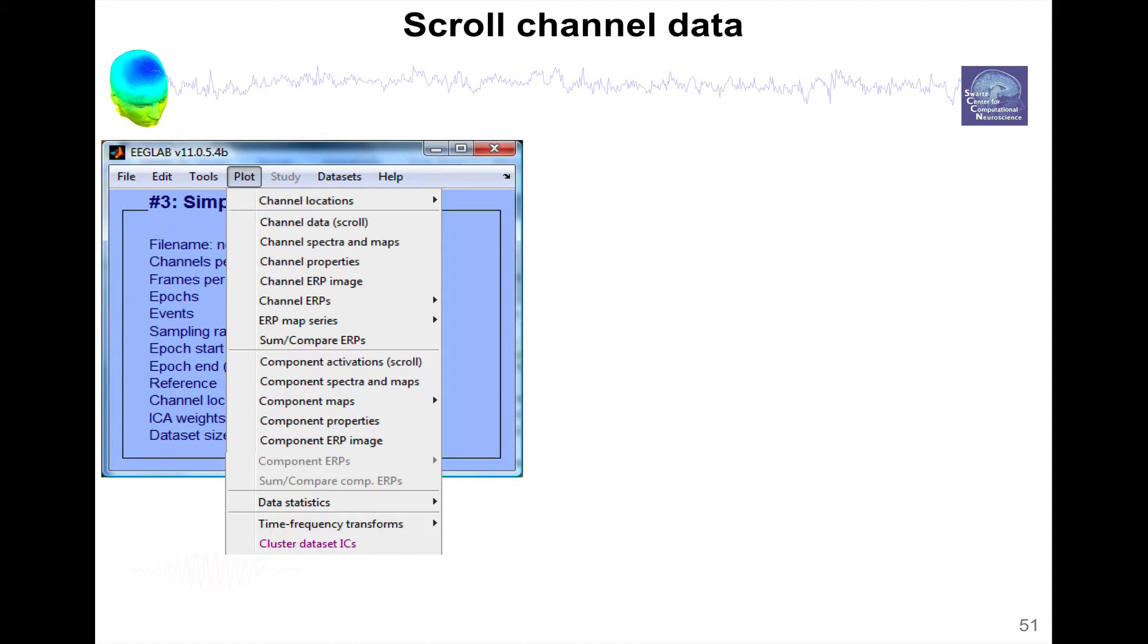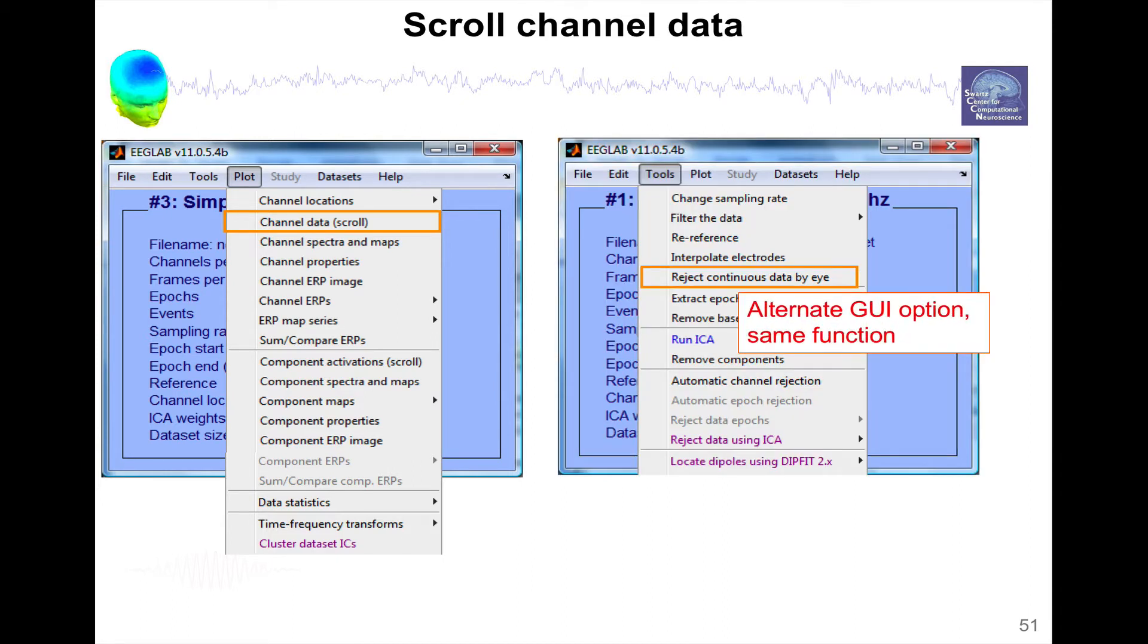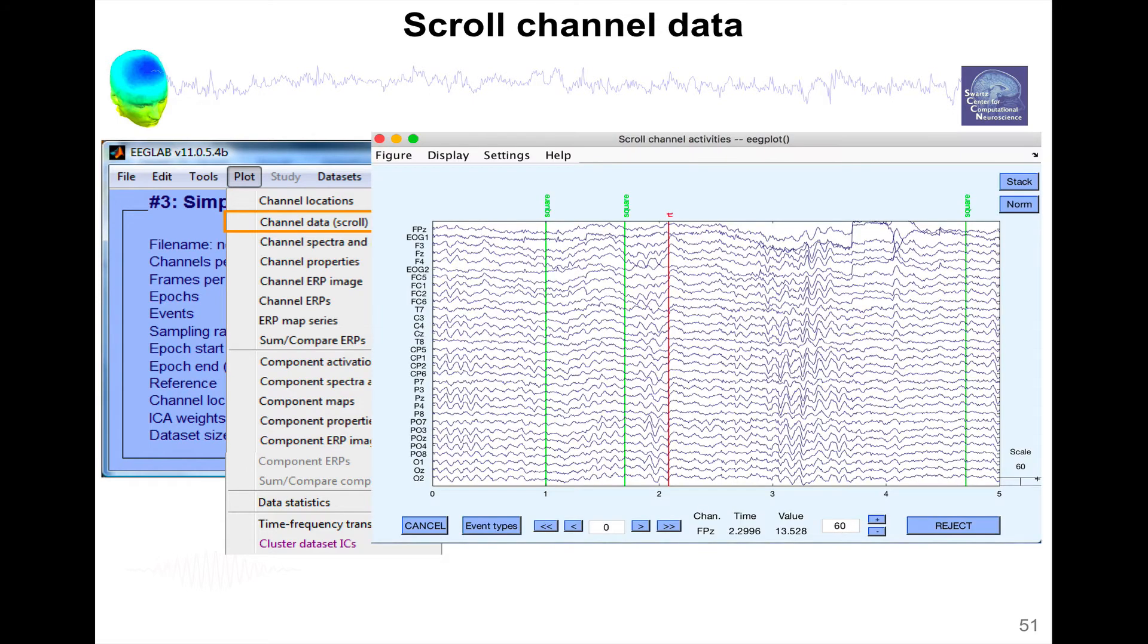There are two menus, there is this menu scroll data, and there is this other menu tools, reject data by eye. Both of the two menus actually have the same functions, you can do the same thing with both menus. And when you click on these menus, then you can see your data.